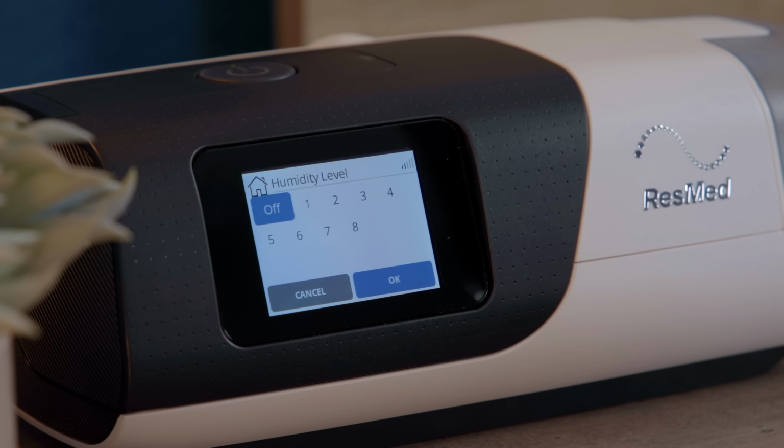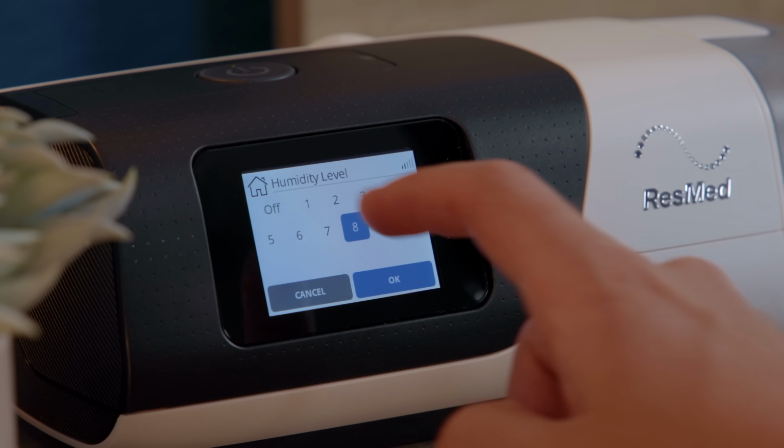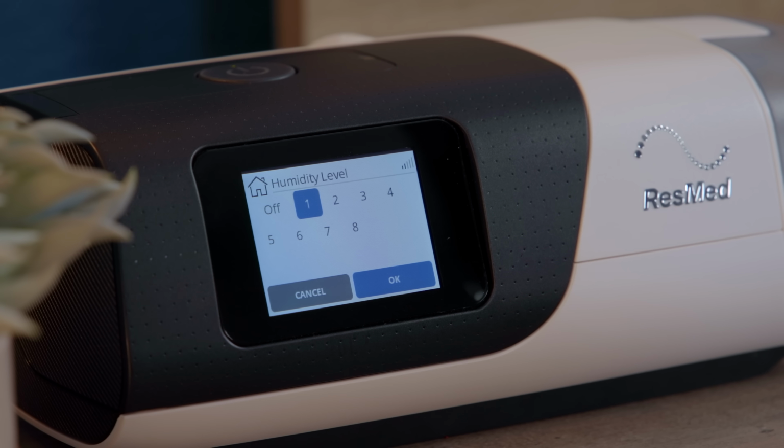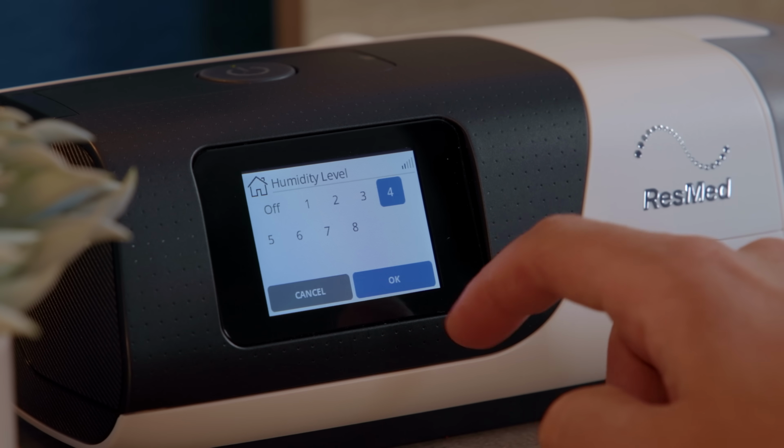This setting can be turned off or set to a numerical level. There is no auto option here, so it's a case of finding the right level for both you and the environment in which you live. Drier climates can need more humidification added than more humid ones. A level of 4 is generally a good place to start, and you can adjust this up or down based on whether you find that you're getting a dry mouth through the night or breathing overly moist air.